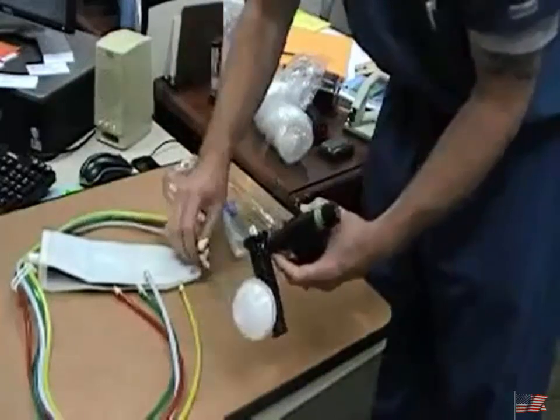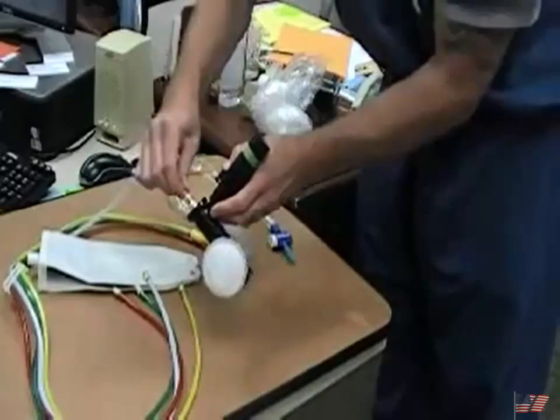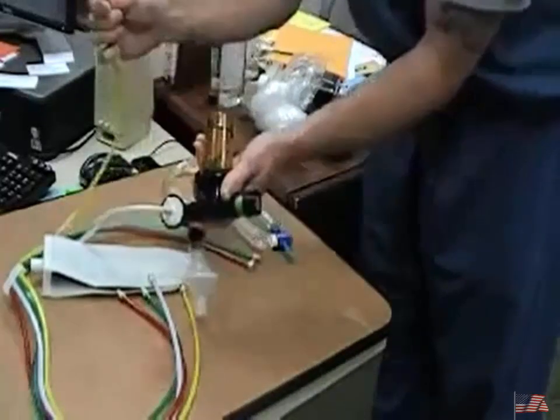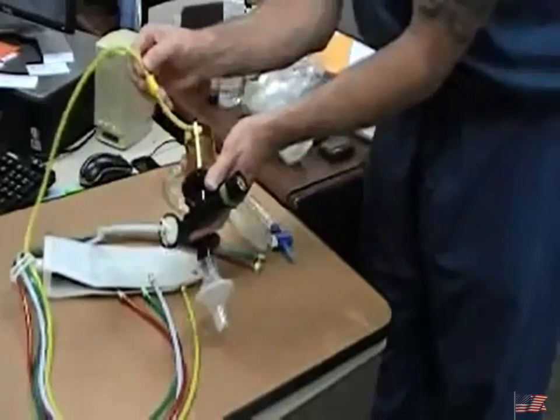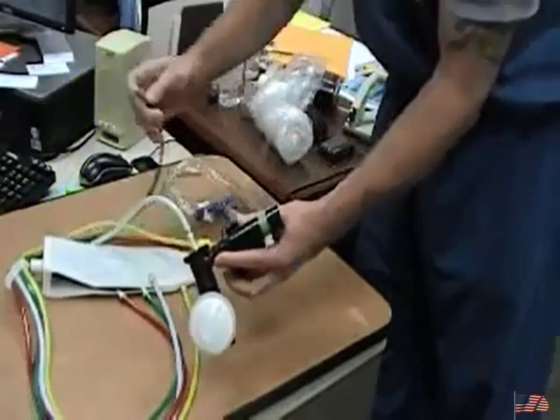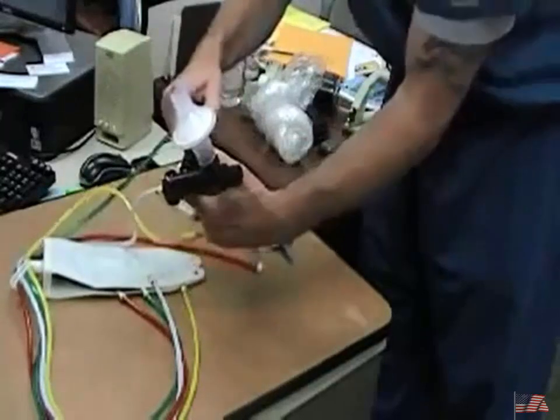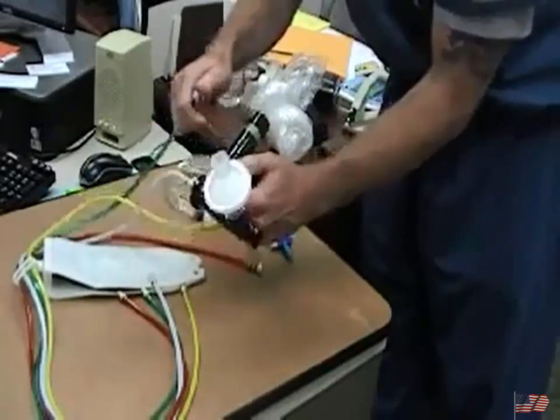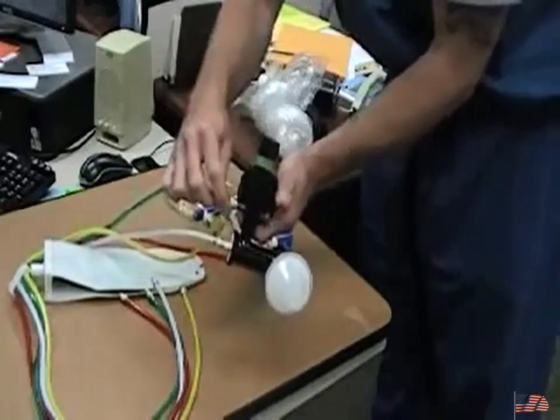Now, to get it set up, it's color-coded. So we go white to white. White's your power line. Yellow is flow for your nebulizer. Okay, remember, arrow goes to the patient. Your green line is your remote switch if you're going to be having the patient control it. With our ventilated patient, that's most likely not going to happen. But to connect it, it would be right here.